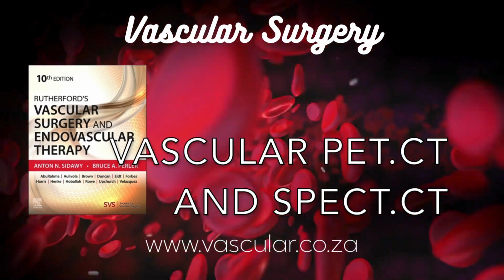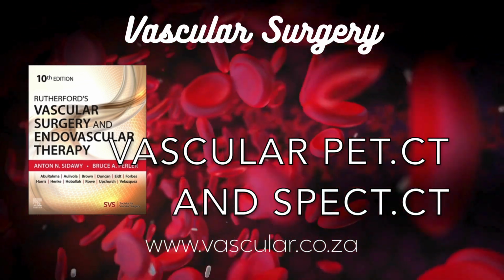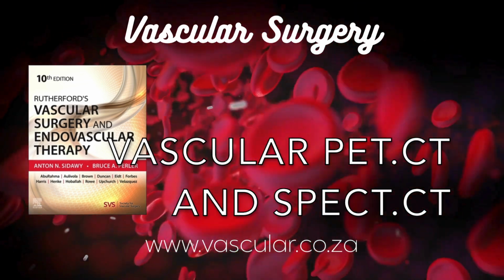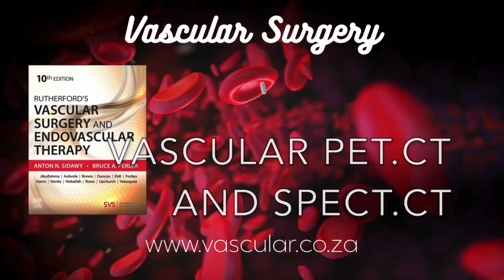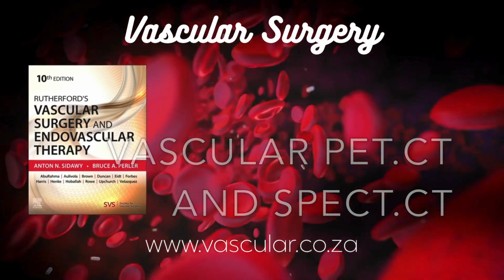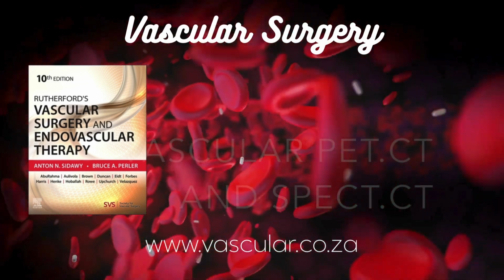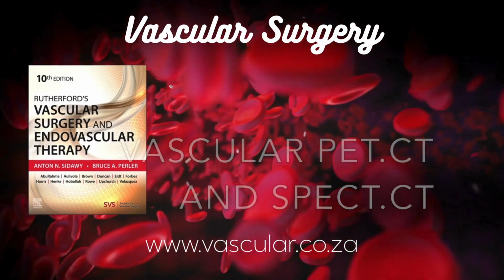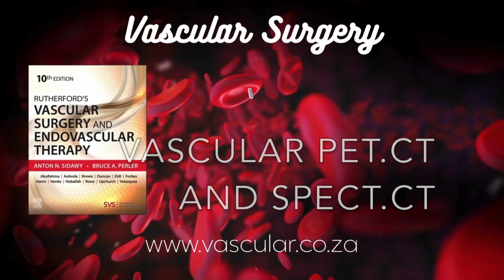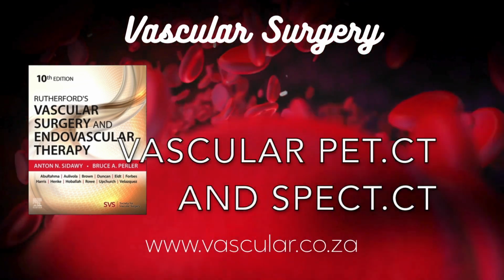The core concept is using these special molecules, radiopharmaceuticals, or tracers. We introduce them into the body, usually an injection. Okay. And these tracers are designed very specifically to latch onto or get taken up by certain biological processes happening at the cellular level. So they're like tiny spies reporting back on specific activities. That's a great analogy, actually. They could target, say, cells with high metabolism, like inflammatory cells, or areas where calcium is being laid down in plaques. And the radio part, that's how we track these spies.